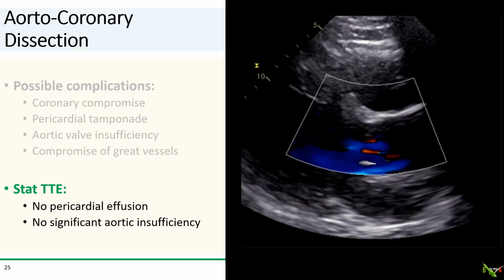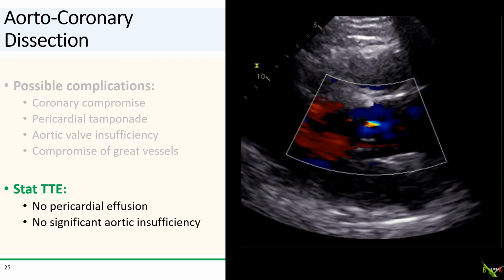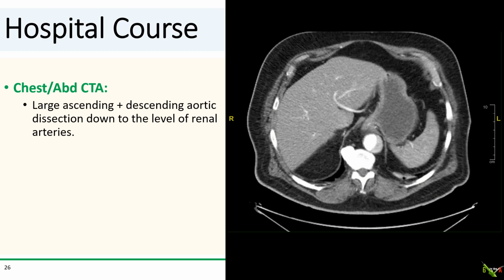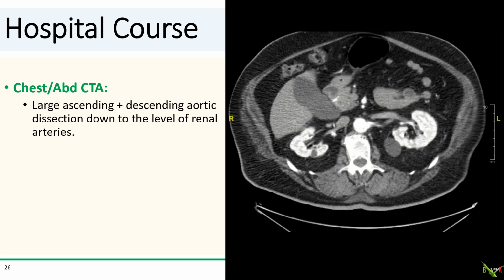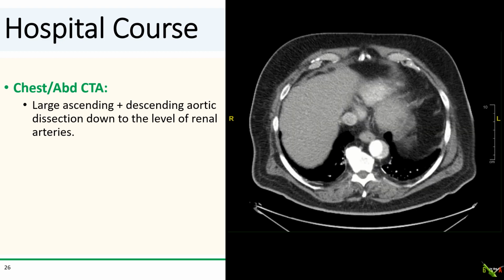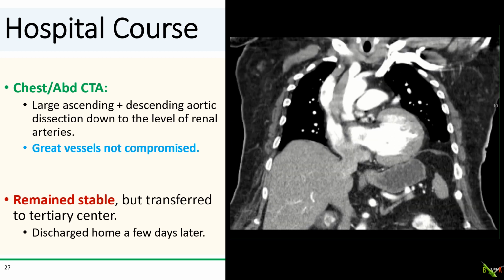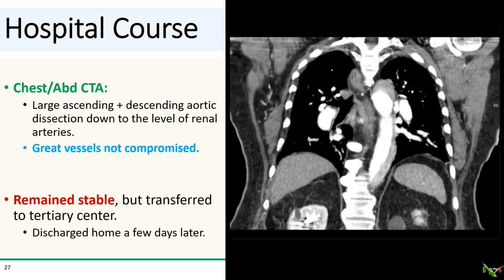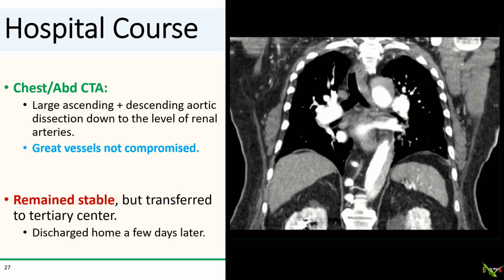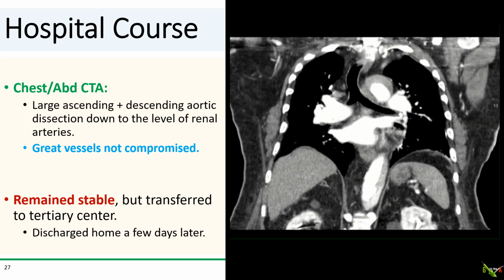So we did a stat echo, which fortunately showed no pericardial effusion and no significant aortic regurgitation. And we did a CT, and this is quite impressive and reveals the true extent of the dissection, spreading up in the ascending aorta around the arch and then down the descending aorta all the way down to the level of the renals. And it was truly remarkable that the patient was not more symptomatic or unstable. Thankfully, the left coronary and the great vessels were not compromised by the dissection. The patient continued to remain stable, but given the large size of the aortic dissection, he was transferred to a tertiary center as a precaution. And fortunately, he was discharged home a few days later.